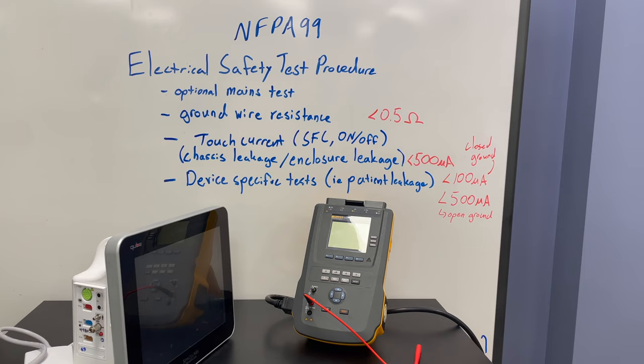The reason I'm using this device is because I want to be able to do patient leakage tests. The limits for a closed ground patient leakage test need to be limited to 100 microamps, and for an open ground configuration the leakage current should be less than 500 microamps.